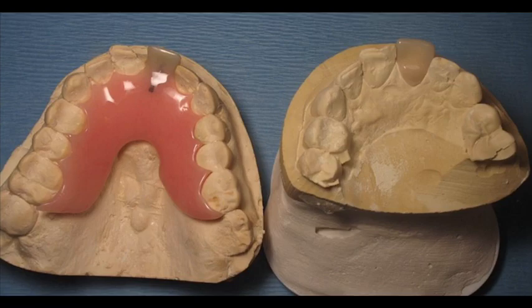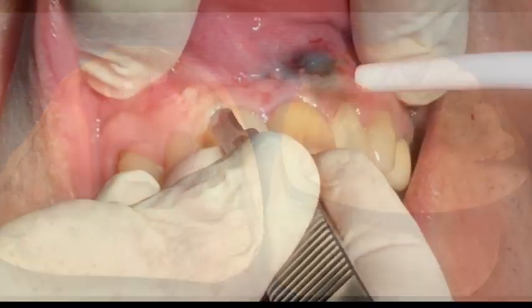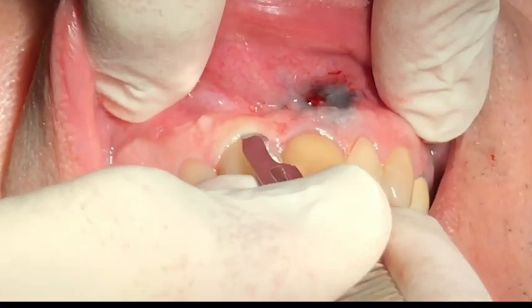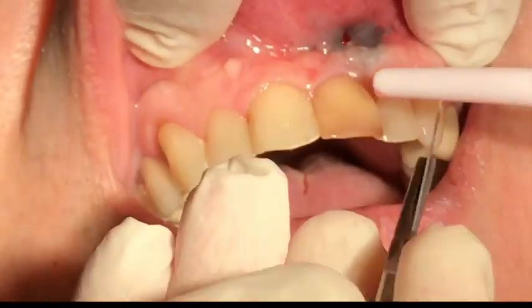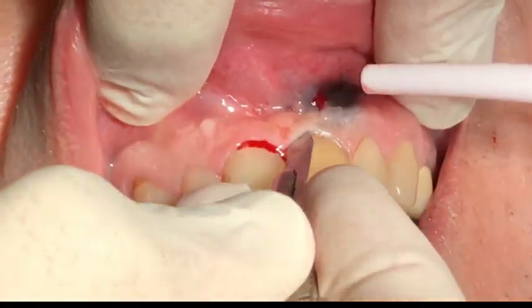The lab made both a flipper and a provisional crown in the event there was such significant bone loss that initial stabilization of the implant cannot be achieved.